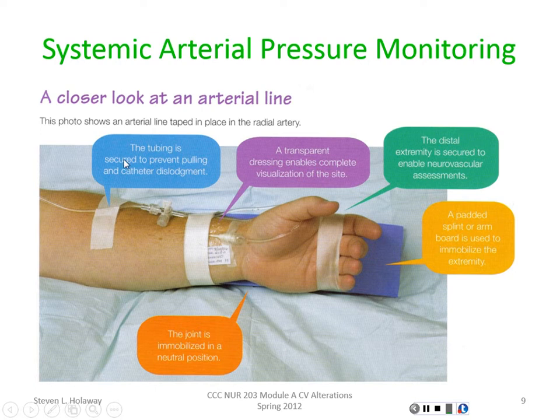Typically on an arterial line, there is a three-way stopcock right down near the line. There's typically a connection, an extension set that goes from the catheter to the stopcock. That stopcock is there so that I can actually draw blood. That's where I'll draw blood.